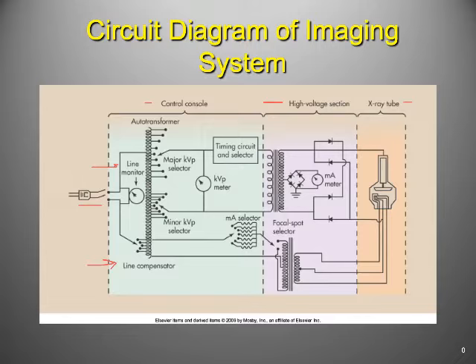There's also natural changes in the power itself. So let's say Pickwick Dam is a little bit down right now and the turbines aren't spinning quite so much, so we're not getting all the cycles of electricity that we would want. It can compensate for that as well, right? So it's going to compensate because we want a fairly steady amount, fairly pure kind of energy, electricity coming into this system, okay? The next thing, moving from left to right, is the auto transformer.